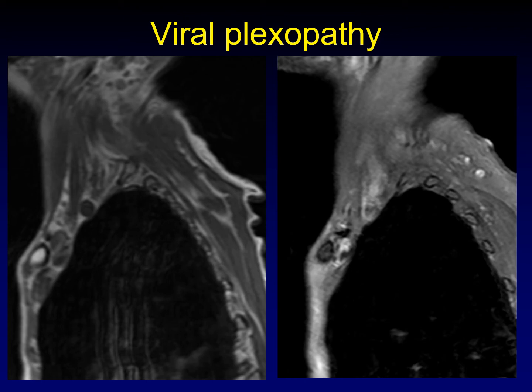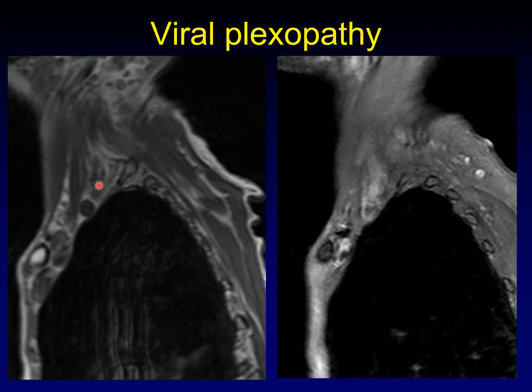Infectious brachial plexopathy is a rare entity. You can see the anterior scalene muscle, and in the scalene triangle, the trunks of the brachial plexus — maybe a little hazy and thickened, but not really striking on unenhanced images. When we move to post-contrast images, there is a striking amount of abnormal enhancement. You know right where to look because of those T1-weighted images, and on post-contrast you find extensive enhancement of the brachial plexus. This happens to be VZV infection of the brachial plexus in an immunocompromised patient.